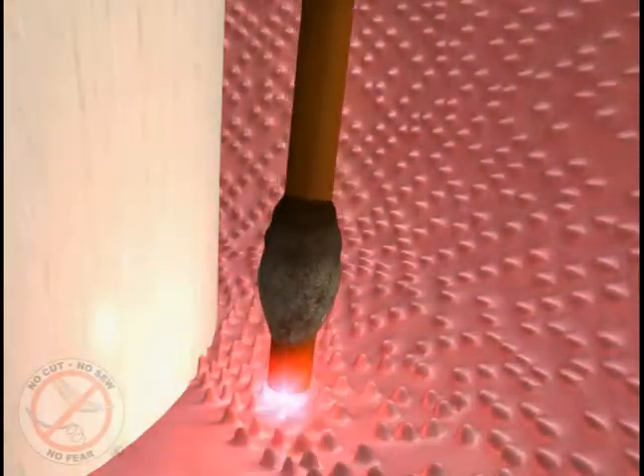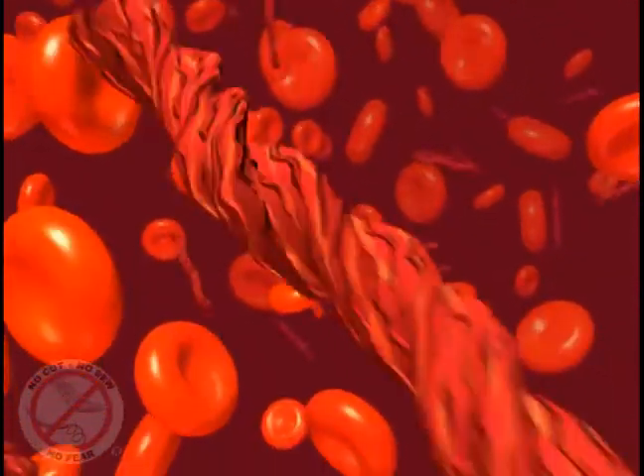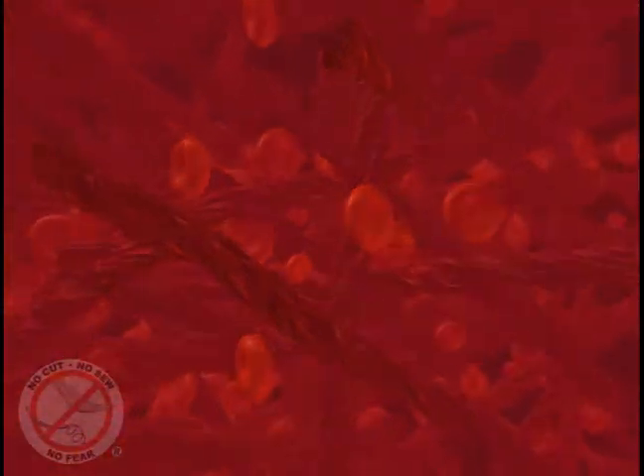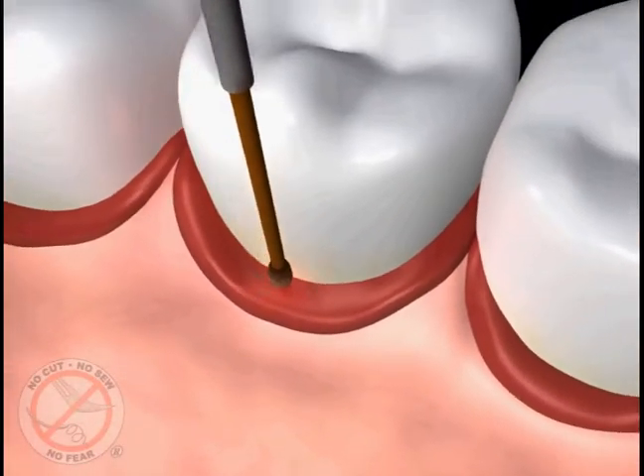It also stimulates the formation of a blood clot, which once formed contains fibers that reattach your tissue to the tooth surface, sealing out debris and bacteria like stitches would, and creates the right environment to cause the bone and other soft tissues lost from the disease to grow back.